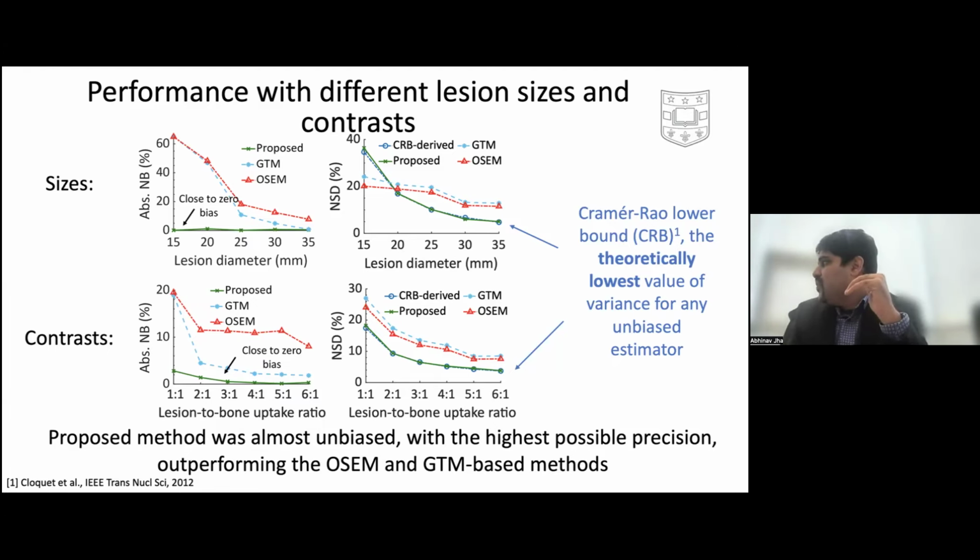Can't you assume it's uniform only for that region of interest, but then for everything else is voxelized? Yeah, so there are adaptive approaches that could be taken. And I think that's another exciting area. If you can do an initial reconstruction, you could say, oh, there is this area which seems almost close to constant uptake, but there are other regions where the activity uptake is more heterogeneous. If I could define VOIs that approximately look homogeneous, then through this methodology, we will be able to estimate activity uptakes in this VOI.